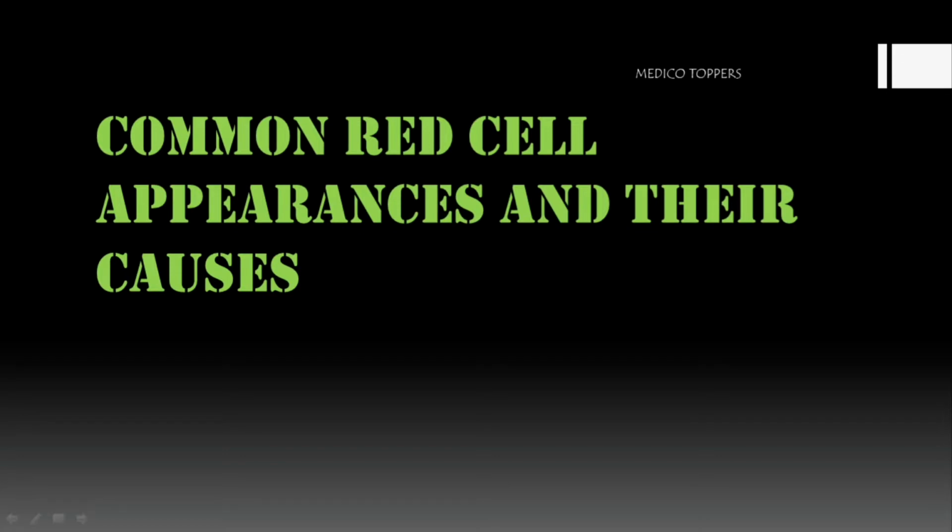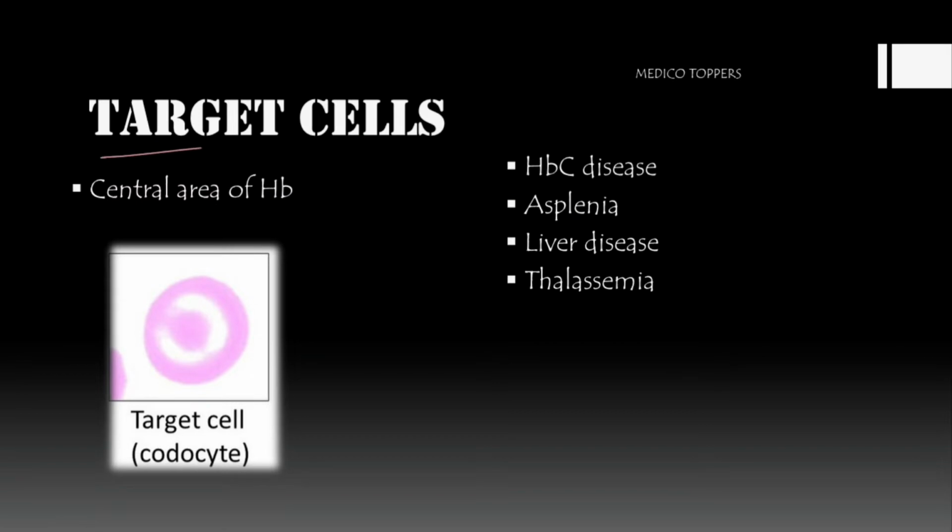And today we are going to discuss important MCQs from a hematology point of view. So it's mainly regarding the common RBC appearances and their causes. So let's see in detail. So first comes the target cell.